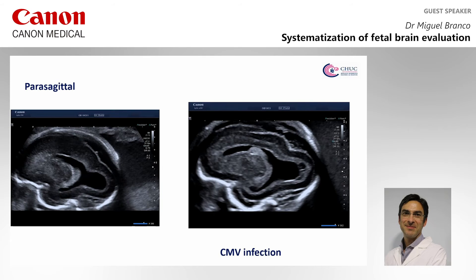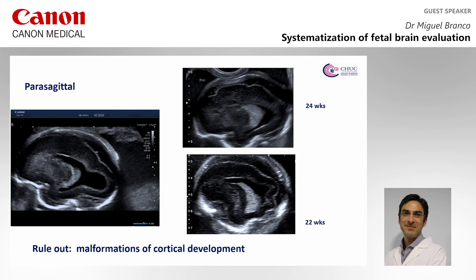This plane is very important in situations of CMV infection like this one. We can evaluate the hyperechoic periventricular area, particularly on the posterior aspect of the occipital horn. It also allows us to rule out malformations of cortical development, as in these situations.